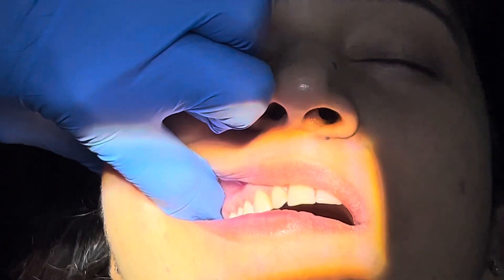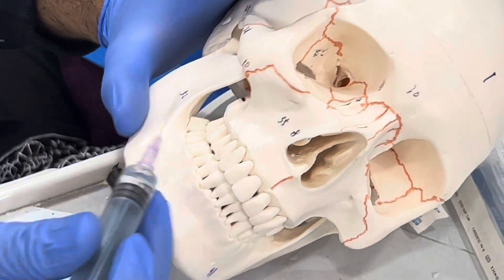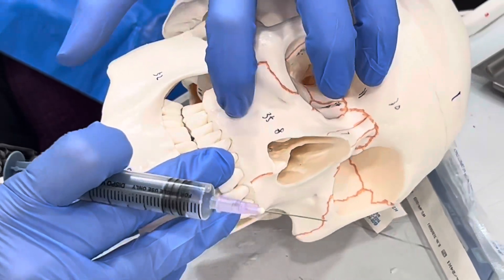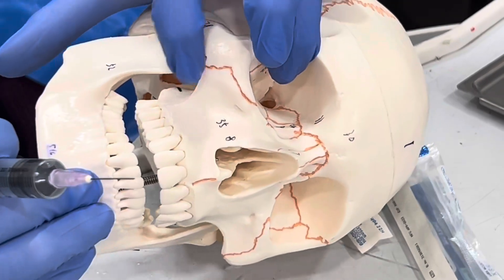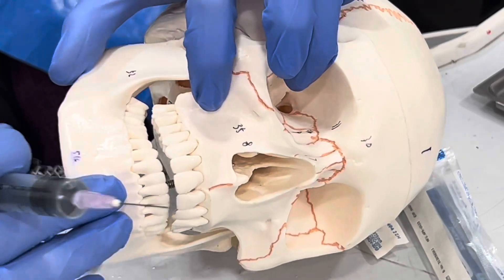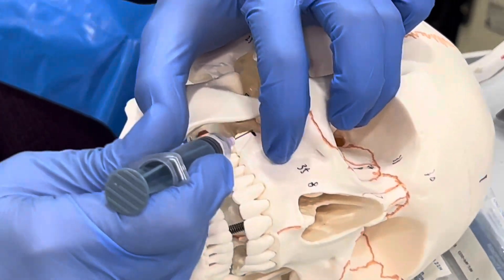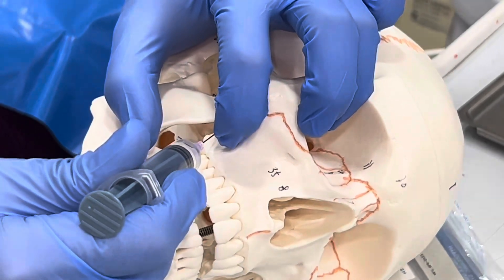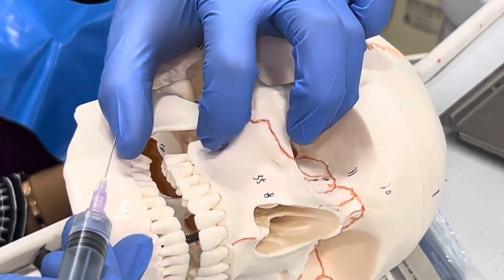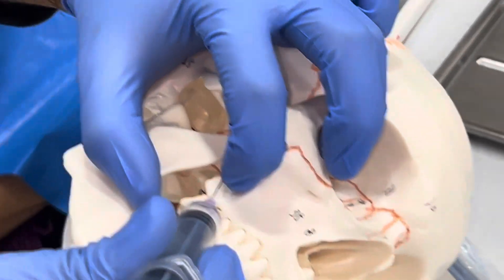If not, then you are done with the PSA nerve block. So let us recap what we have done: we palpated the zygomatic process of the maxilla, asked the patient to open a bit, and inserted our needle just above the second molar at 45 degrees, reaching the infratemporal surface. Our finger was already at the depression, and we injected, depositing the solution at that point.